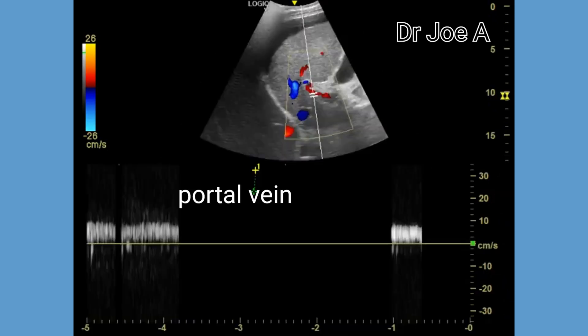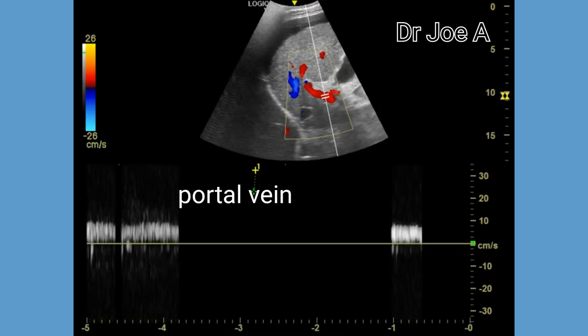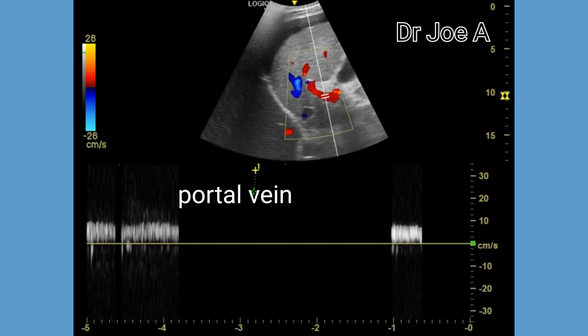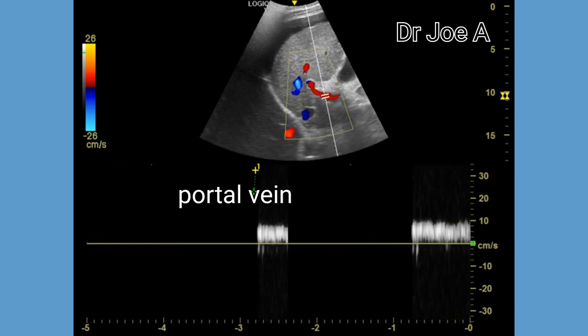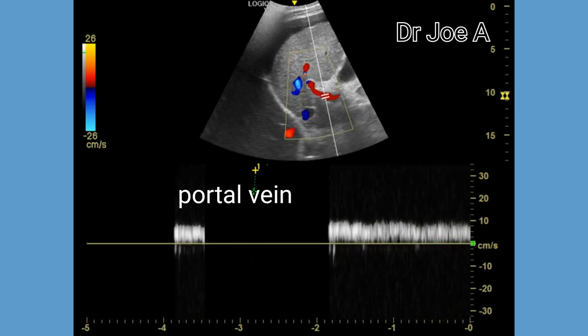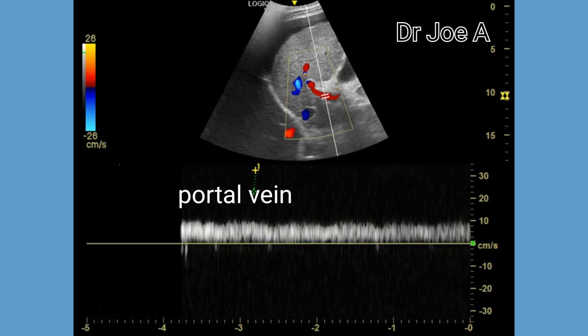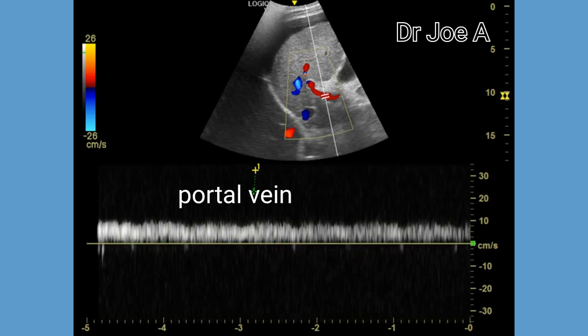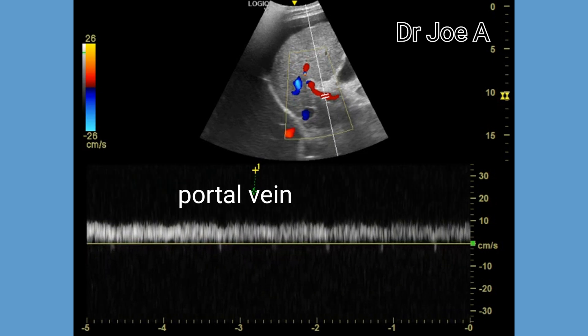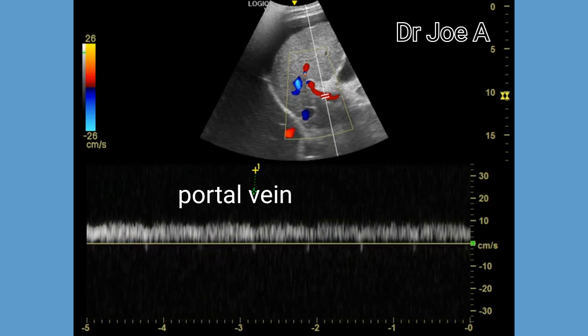Next we come to the spectral Doppler of the portal vein, which appears normal. There is forward flow and normal phasicity — another good sign.